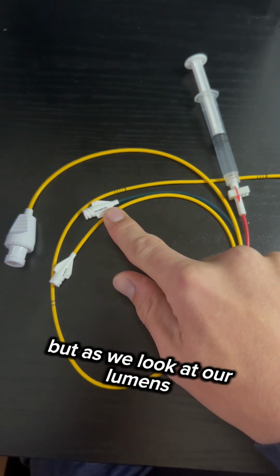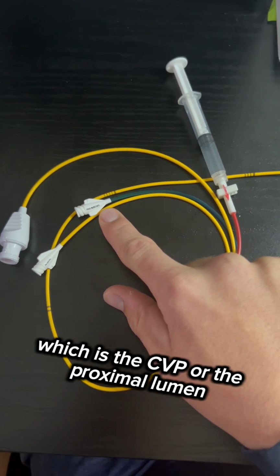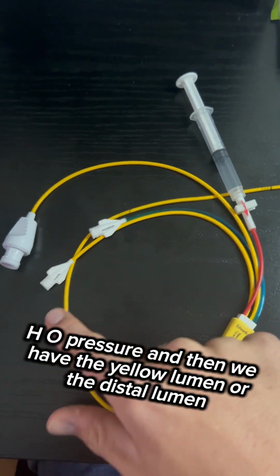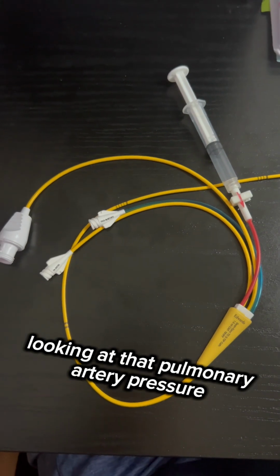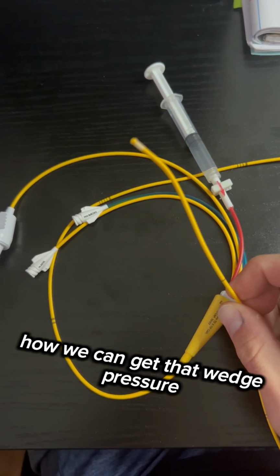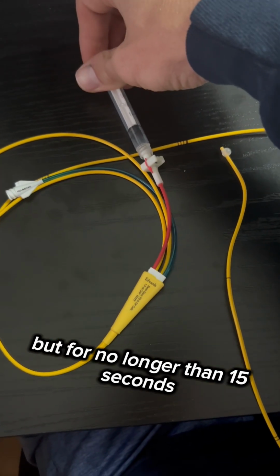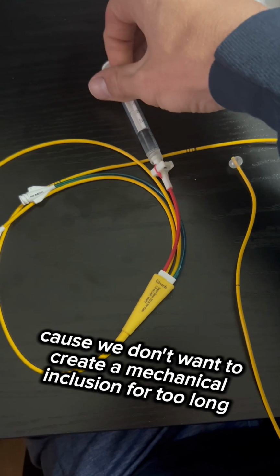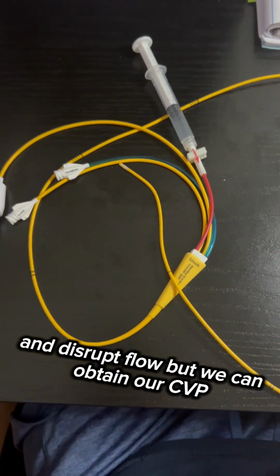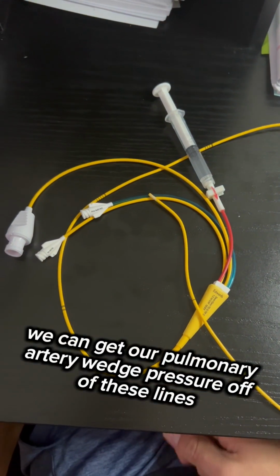As we look at our lumens, we will see that we have a blue lumen, which is the CVP, or the proximal lumen, looking at that right atrial pressure. And then we have the yellow lumen, or the distal lumen, looking at that pulmonary artery pressure. And as we mentioned before, how we can get that wedge pressure is we're going to inflate that balloon, but for no longer than 15 seconds, because we don't want to create a mechanical occlusion for too long and disrupt flow.